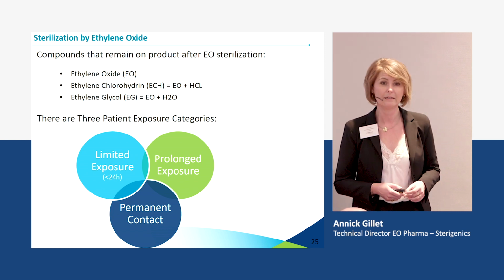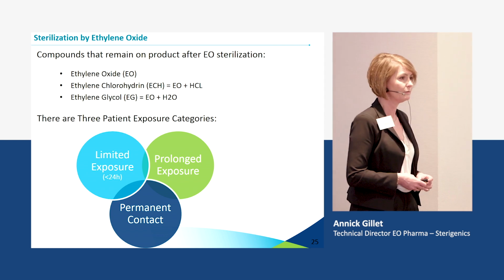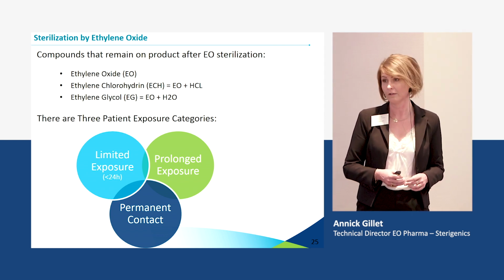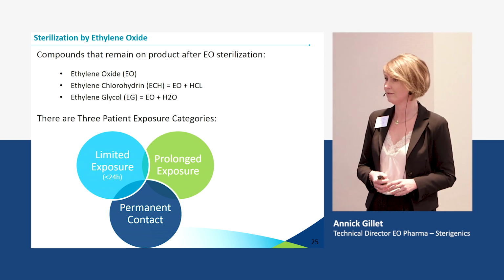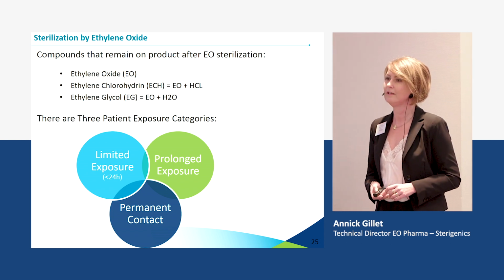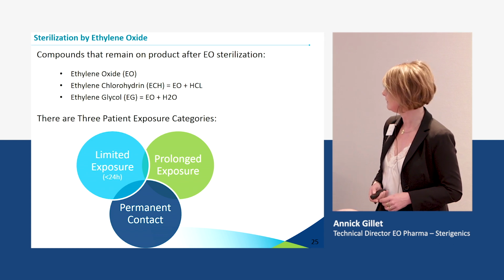And recently we had a new standard published about the neonates. So there again you have different limits to apply if your product is to be used on small patients like babies or even newborns of 1 kilo. It's not the same compared to an adult of, let's say, 60 or 70 kilos.